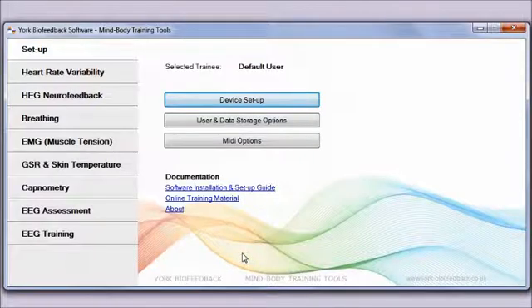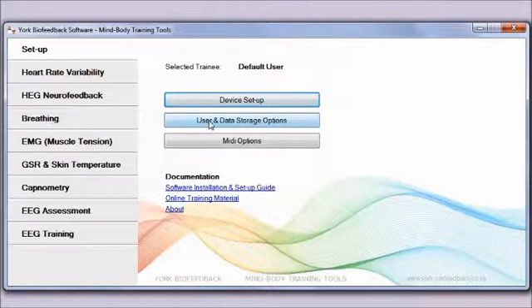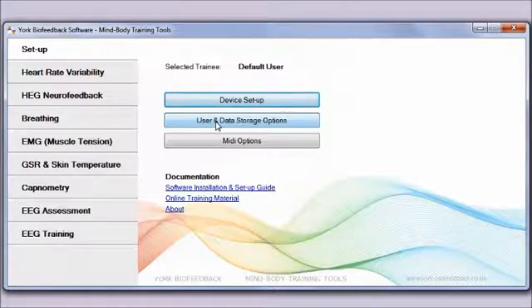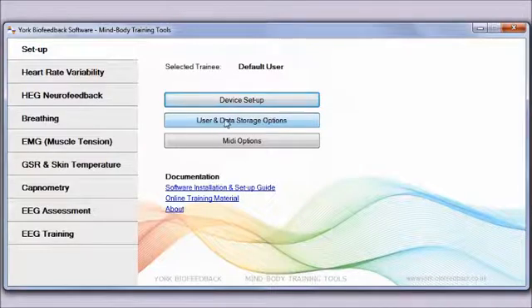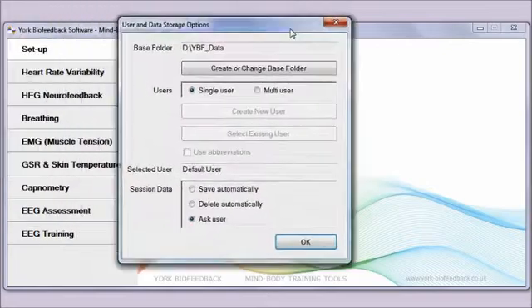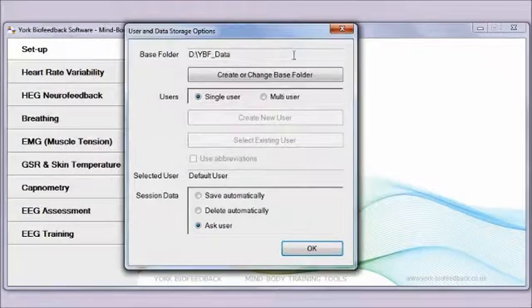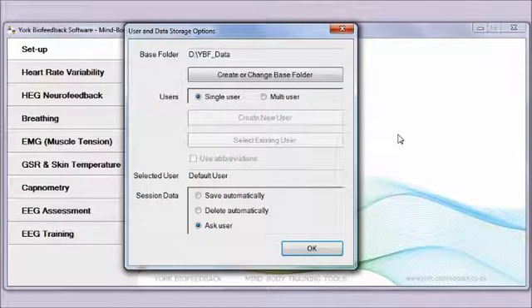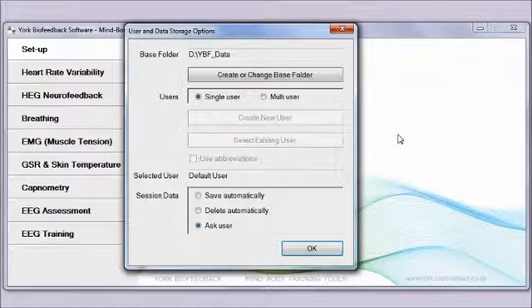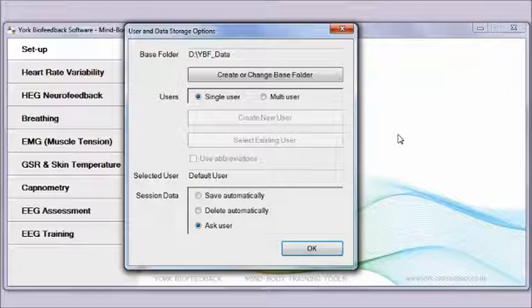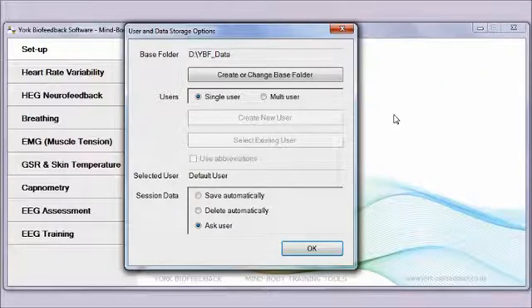The second step is you need to configure the user and data storage options. I'm clicking the second button here. This is about when you run the applications, the software will write a session file that it uses to generate reports if you want to view a session report. It needs somewhere to store that data, so this step is to nominate where you're going to save that data to.